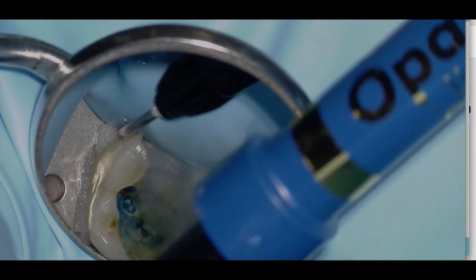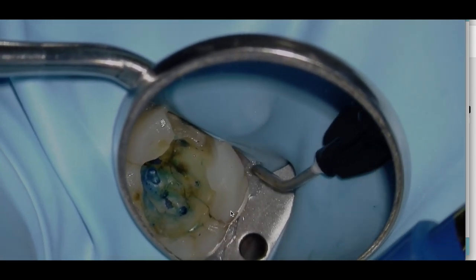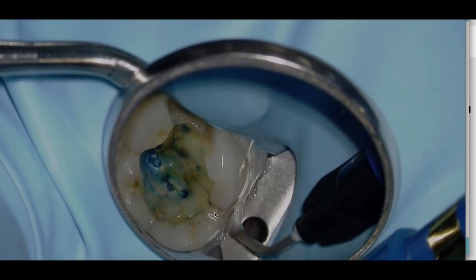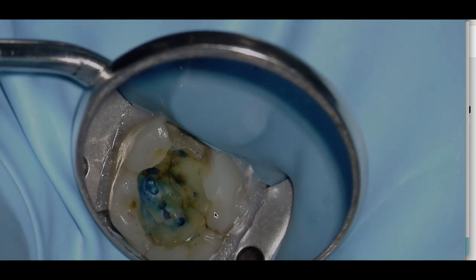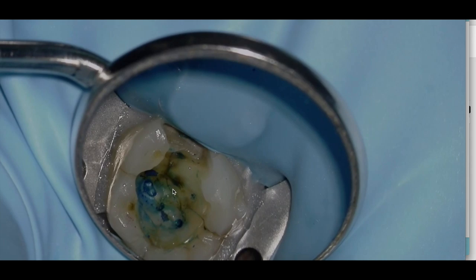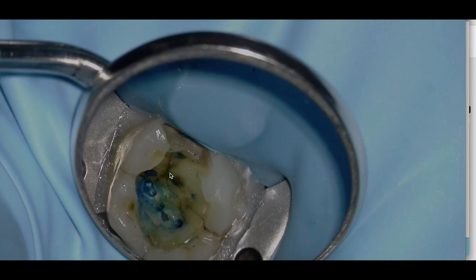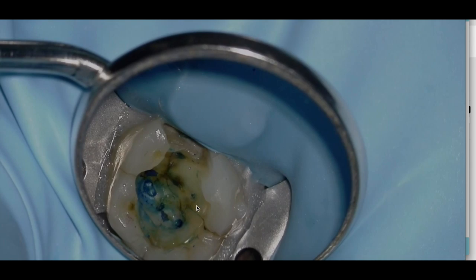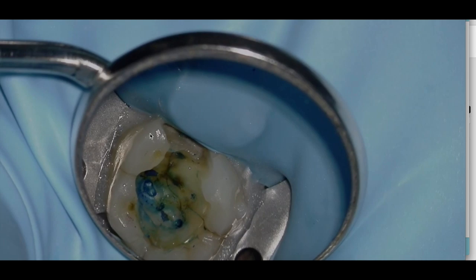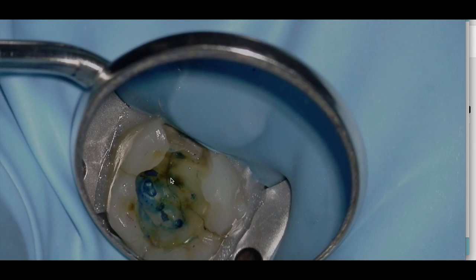We're going to place our secondary seal with Opal Dam. And you can see the rubber dam clamp is still open, so we need to close those up to make sure we don't get any saliva into our endo and also our irrigants into the oral cavity. What I've done there is I've taken methylene blue dye - and I haven't touched the tooth at all, this is the way it presented. You can see we've got this fracture running all the way down from the mesial of the tooth. If this is the mesial buccal and this is the palatal, we've got that fracture line running just through the pulpal floor or the roof of the pulp chamber.